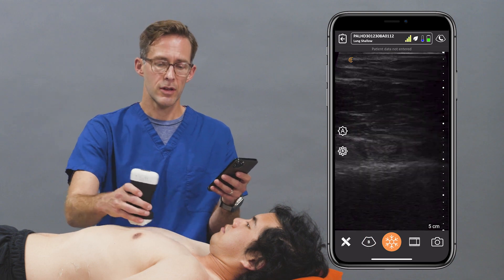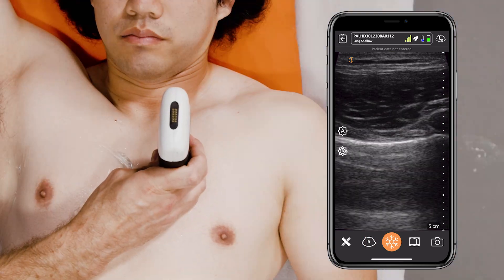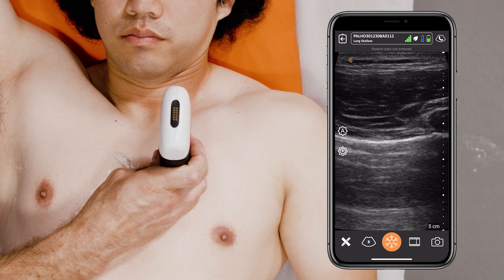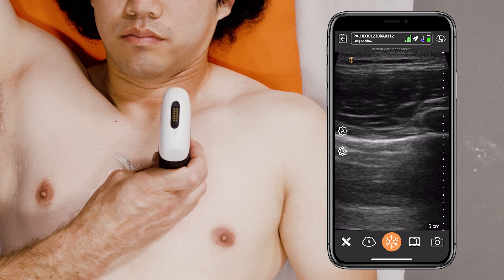You do the same thing on the other side — just anterior chest, looking for that good lung sliding.